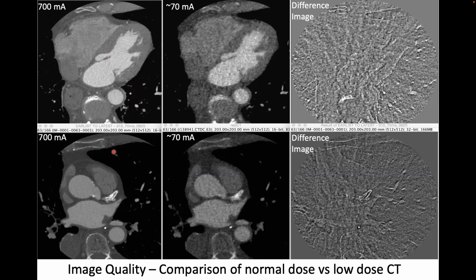And it's not just a signal to noise issue, right? What happens when you go to these lower doses is that in order to create a picture that doesn't have crazy artifacts in it, you need to look at your raw data and smooth it out. And when that happens, your spatial resolution goes down, right? So it's not just a signal to noise issue, it's a resolution issue. And every scanner that you can buy commercially, if you start dropping the dose, will start ramping up the preconditioning of the data such that the image you get is blurry.